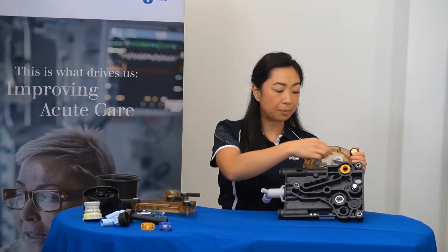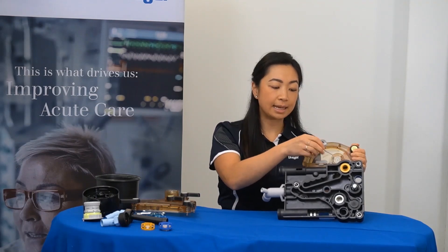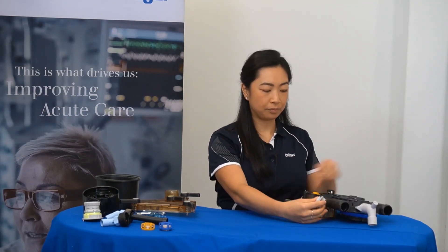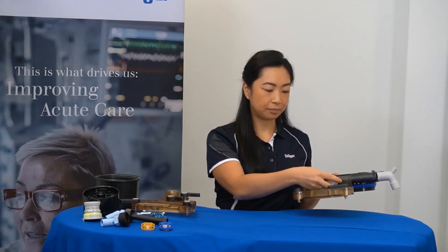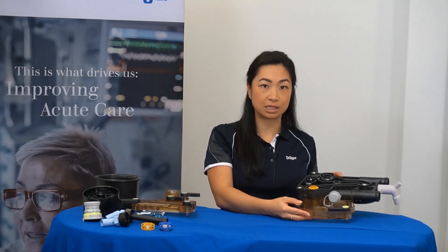From here, the oxygen sensor cap can be unscrewed and placed into the holder that is seen here. For devices that have an oxygen sensor, this is when you remove the oxygen sensor.